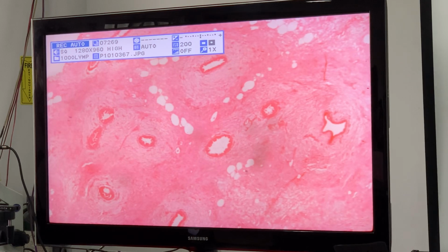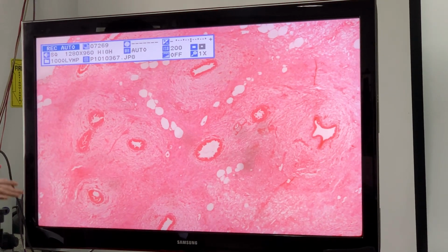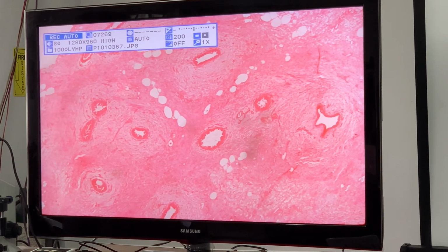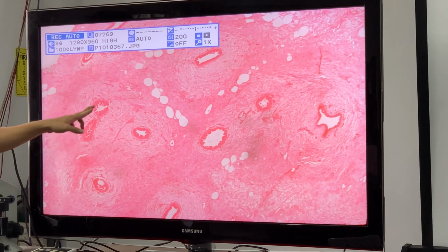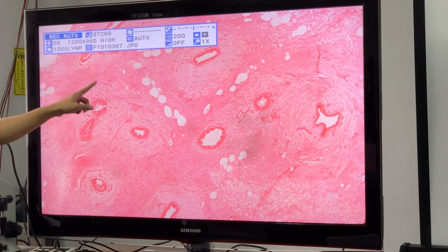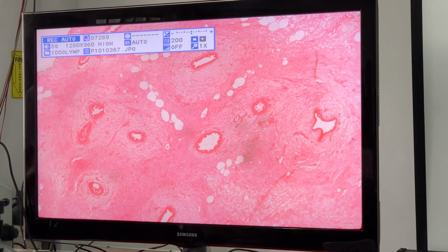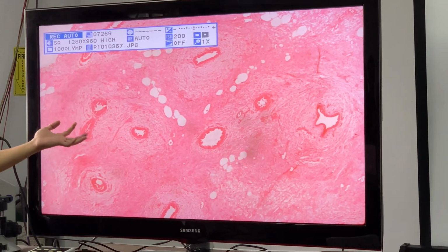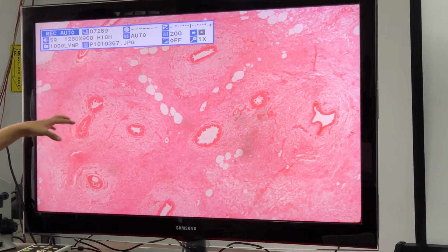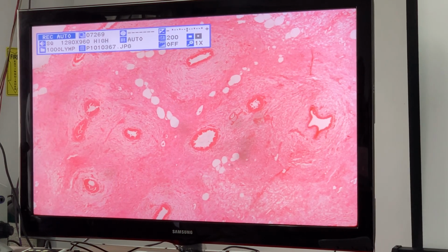You don't know this one, but I'll explain it to you. You might recognize it. This is another breast, but there's something a little bit unusual. These are ducts, but there are no glands, and there's a lot of stroma here. Usually the breast is a little bit fatty. This is the breast of a male patient that had gynecomastia. Male breast, large one. What happens here is the ducts proliferate, so there's a proliferation of ducts, causing the breast to enlarge.